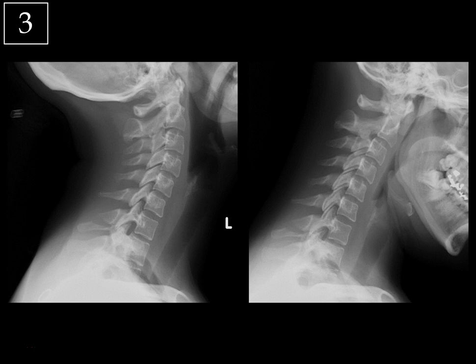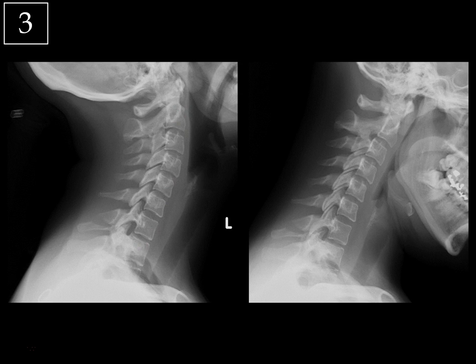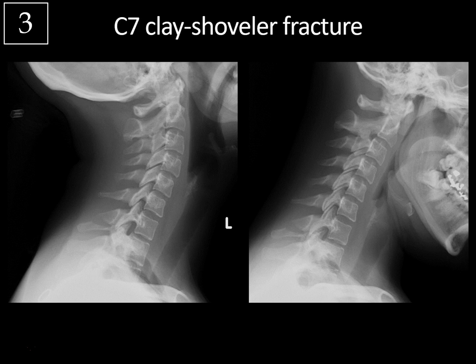We're looking at two lateral views of the cervical spine. You're looking for prevertebral soft tissue swelling — anterior to C3, no more than 7 mm; anterior to C7, no more than 21 mm (remember: 3 times 7 is 21). Vertebral body heights and disc spaces look relatively normal. The key alignment lines are: the anterior longitudinal line, posterior longitudinal line, articular pillars, the spinal laminar line, and the spinous process line. That's where we catch the fracture here of the spinous process of C7 — typical for a clay shoveler fracture.